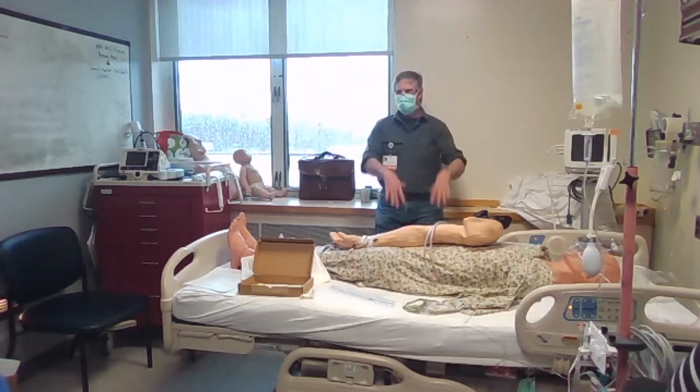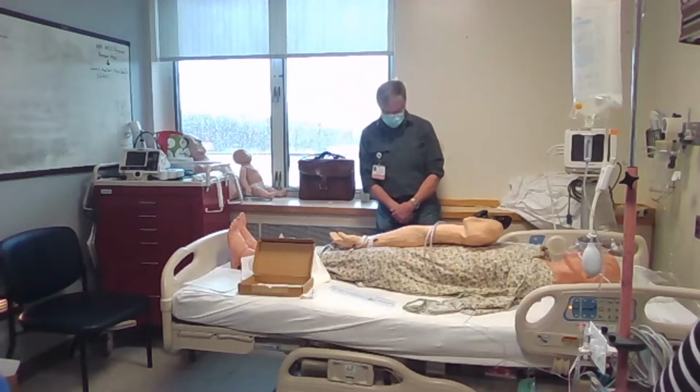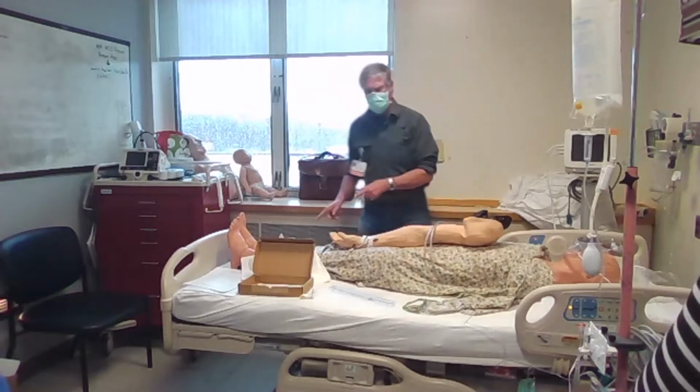Is the actual insertion a nursing procedure or a doctor procedure? A physician or respiratory therapy would. Respiratory therapy can do it, but not here. Maybe some places, if people have training, it's in scope, but not here. You can shut the tubing up. Yeah, that's setup.